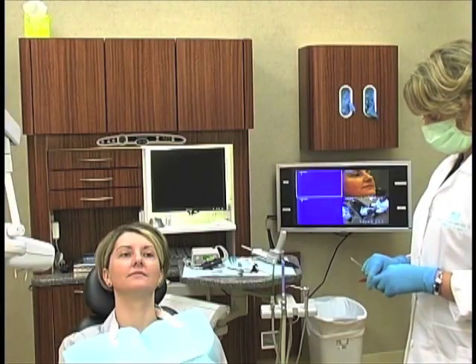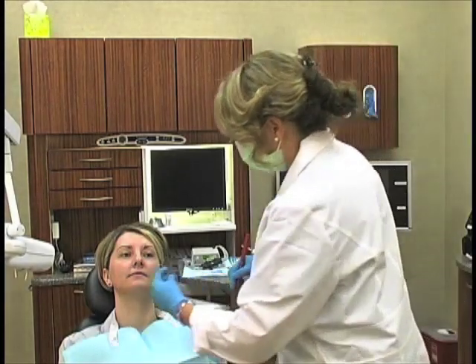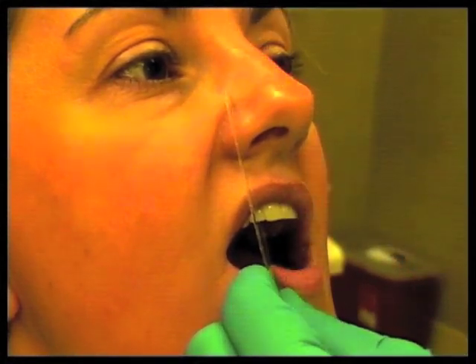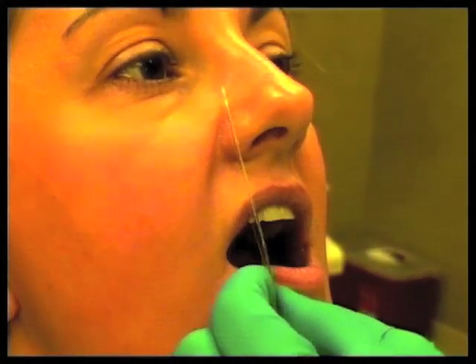To start this process, we're going to use something called the reference plane locator — a little ruler with one aspect that goes on the patient's lateral incisor. Once it's sitting on the lateral, it makes a point up on the lateral aspect of the right side of her nose. We just take a little marker and make a dot. That dot is important for knowing where the face bow is going to sit on her face in the vertical plane. One of the things that happens with other systems is that with longer faces or variations from the norm, the cast ends up not centered on the articulator — the maxillary cast ends up very high with canted occlusal planes. This face bow system has just about completely eliminated that.